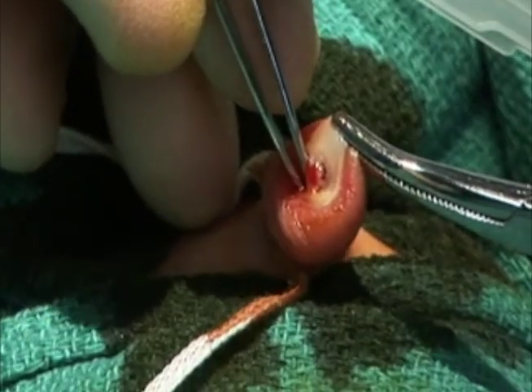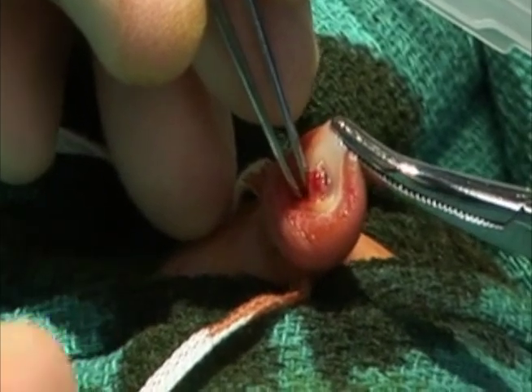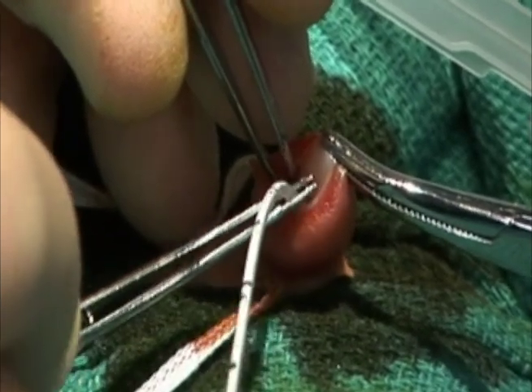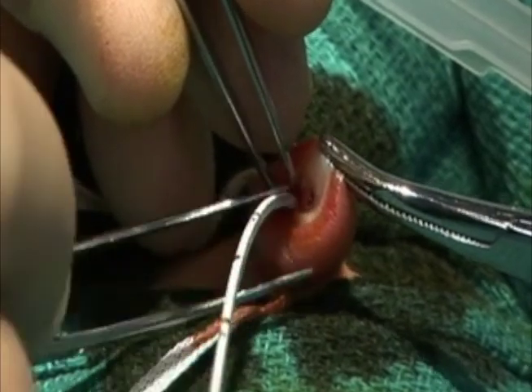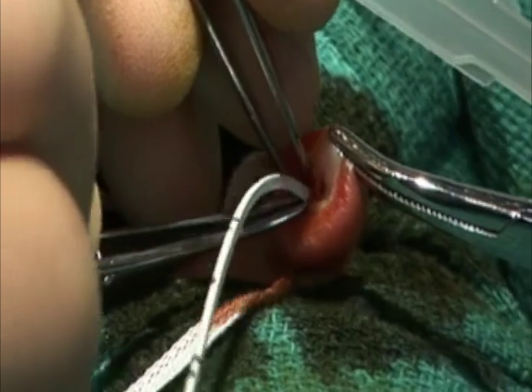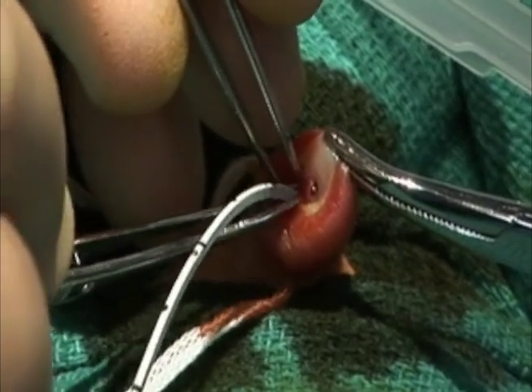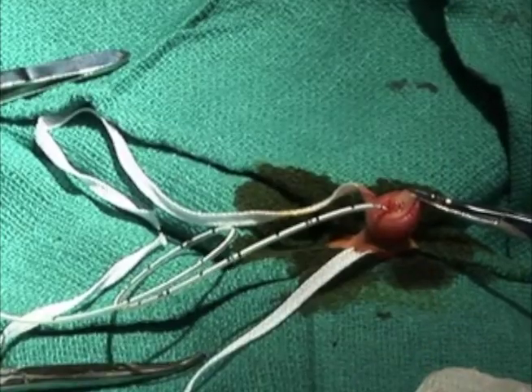Use your dominant hand to grasp the catheter 1 centimeter above the lumen using the other mosquito forceps, or using the thumb and forefinger, slide the catheter between the tips of the forceps within the umbilical artery. Using a firm, steady motion, pass the catheter 1.5 to 2 centimeters into the artery and remove the indwelling forceps. Grasp the cephalad portion of the cord with the toothed mosquito forceps and apply traction in the cephalad direction to assist in passing the catheter deeper.